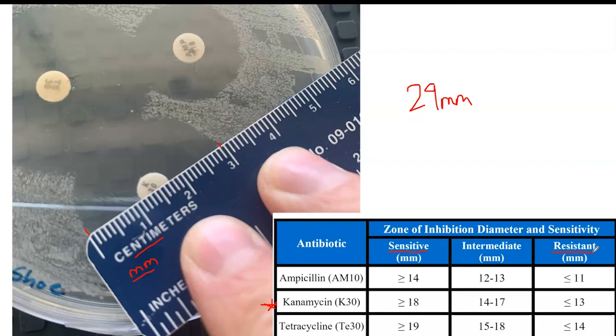So this is a really important clinical finding. If we say a bacteria is sensitive to a particular antibiotic, then that means that's a usable antibiotic that can be appropriate to treat a particular infection. The flip side of that coin is, if we say a bacteria is resistant to a particular antibiotic, well, that means that antibiotic can't and shouldn't be used because the bacteria can grow in its presence.